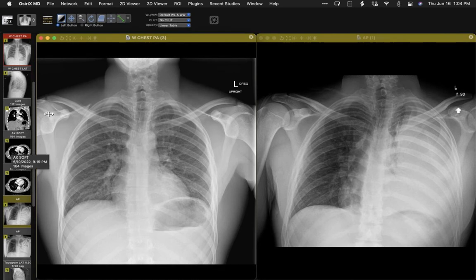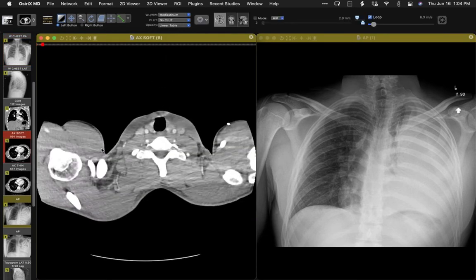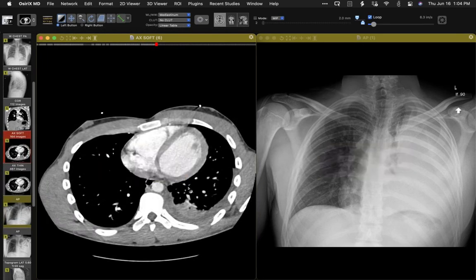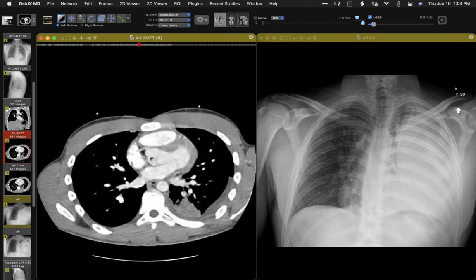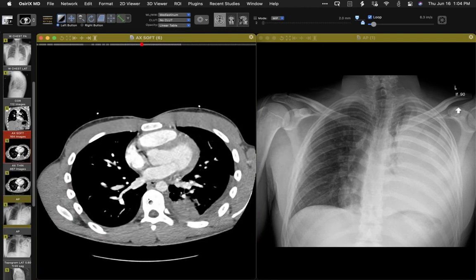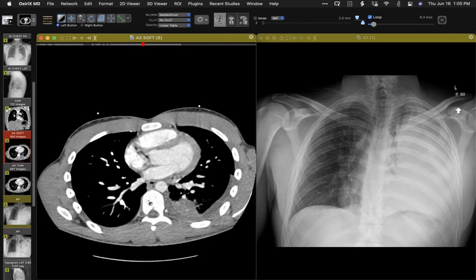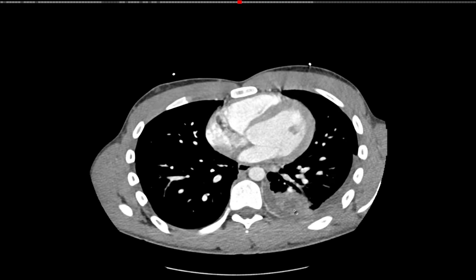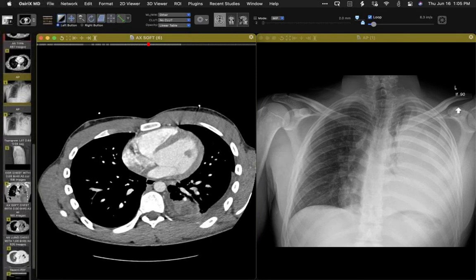Let me show you the CT done on the 10th alongside this. You can see the pleural fluid. This is three days before, when only a relatively small amount of fluid is present. Opacity is present in the left lower lobe, but a key, relatively subtle image is here in the left lower lobe — a circumscribed area of lower attenuation consistent with, in the face of an acute illness, a focus of necrotizing pneumonia or abscess.